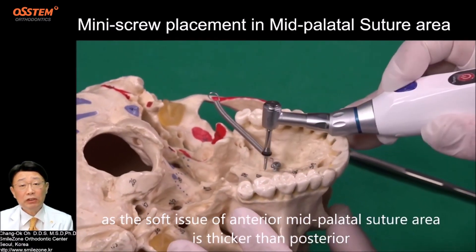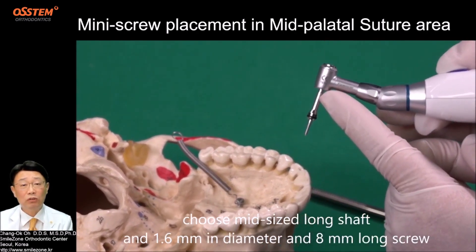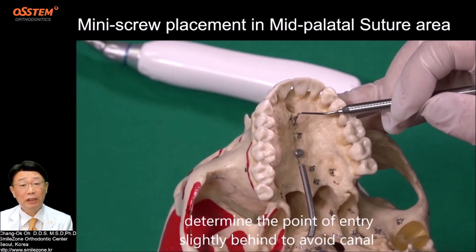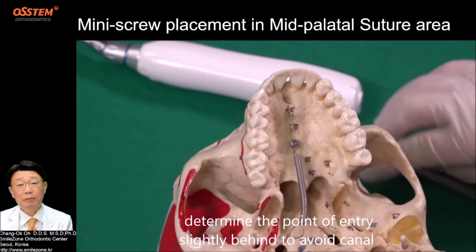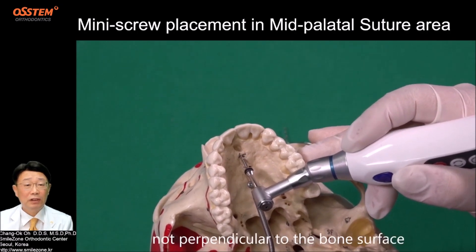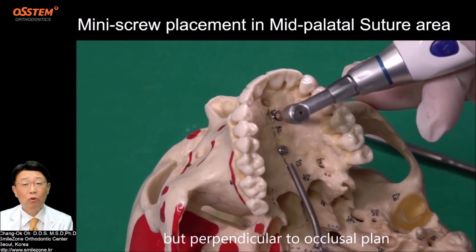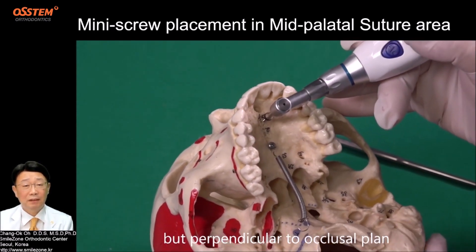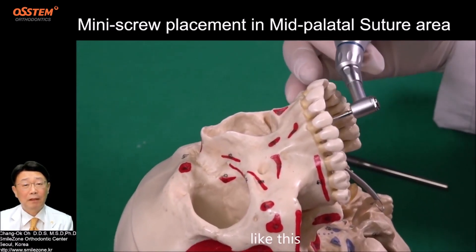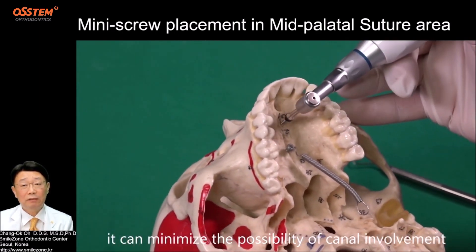As the soft tissue of the anterior mid-palatal suture area is thicker than the posterior, choose a mid-size long shaft and a 1.6 mm diameter, 8 mm long screw. In summary, determine the point of entry slightly behind to avoid the canal, and set the path of insertion not perpendicular to the bone surface but perpendicular to the occlusal plane — this minimizes the possibility of canal involvement.